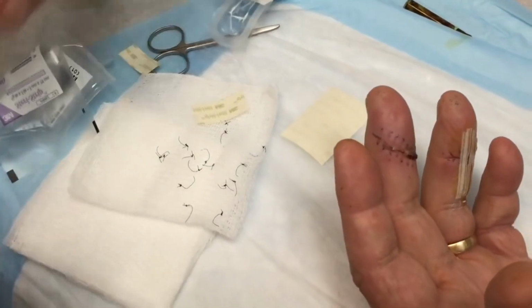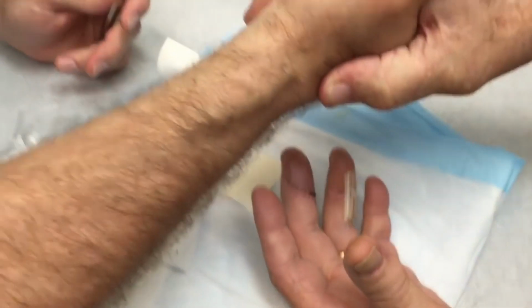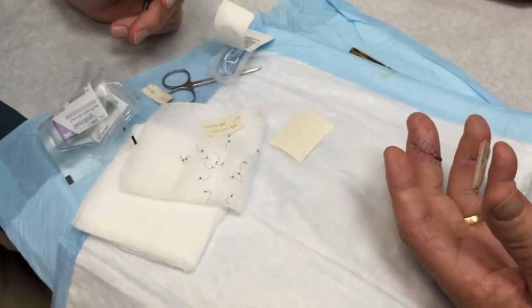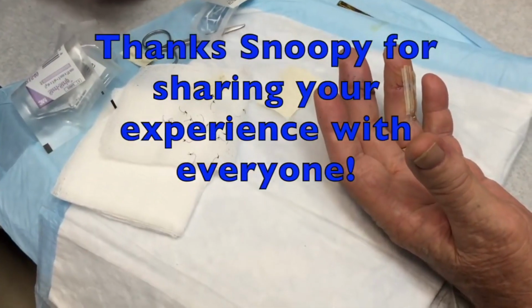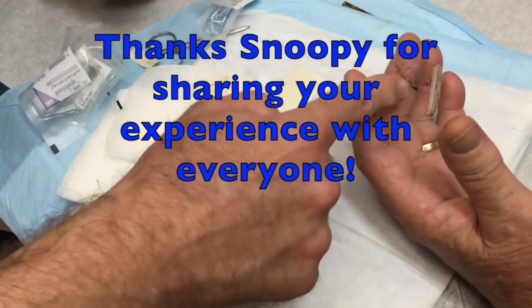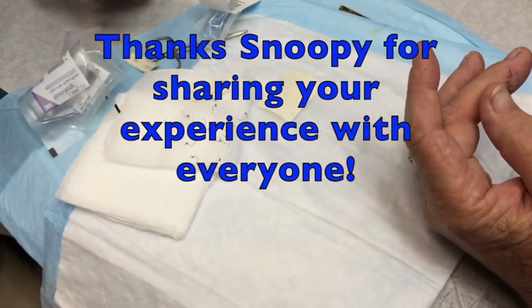All right. You did great, man. Thanks for letting us video. You're a pal. The other one's fine, closed up good enough. We can just put a bandage over it. That one was so deep. This one was probably tender, and you probably weren't as aggressive with it. It was a little tender.